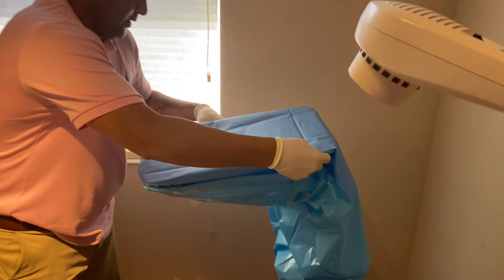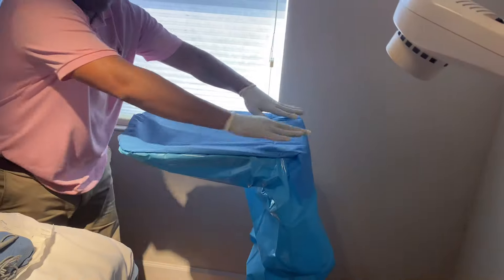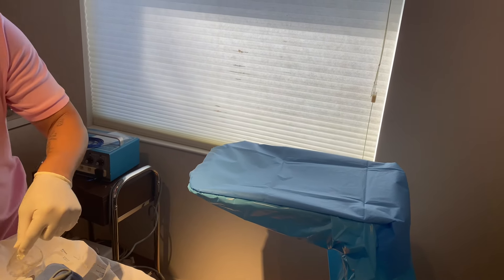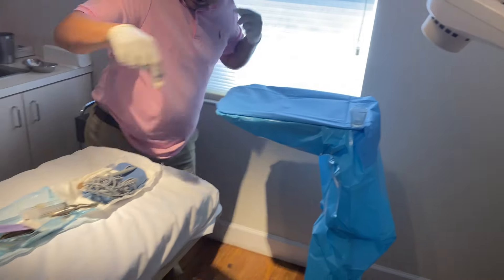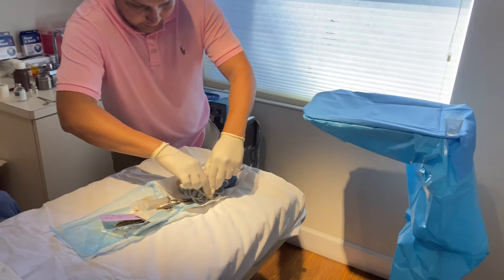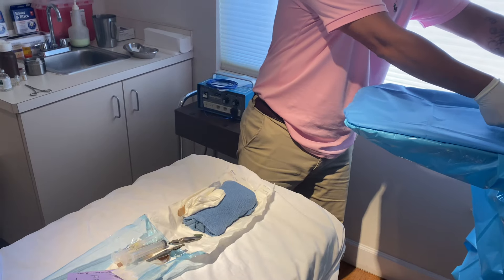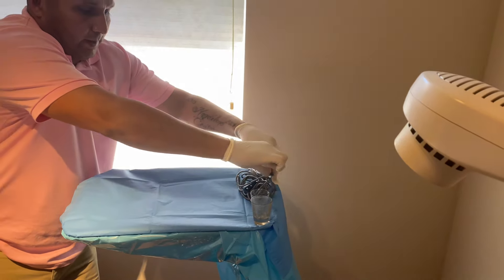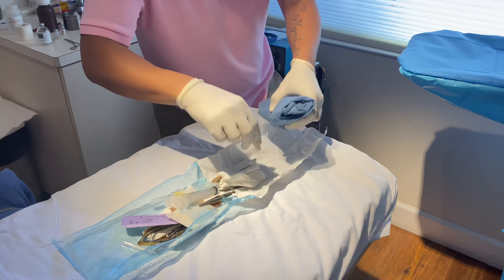You can set up the reversal in whichever way you choose. This is the way I was taught by Vivian. I start off with the shot glasses, which is where we put in our saline. Then you have your cautery wand here — I'll put this right here, out of the way.